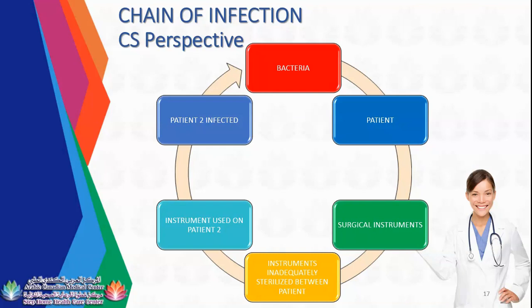In the autoclave, guys, you can do quick sterilization and the regular sterilization process, which is the standard. The quick sterilization, or immediate use steam sterilization, should only be used in emergencies. It should not be used just because you don't have enough instruments. It's not allowed.